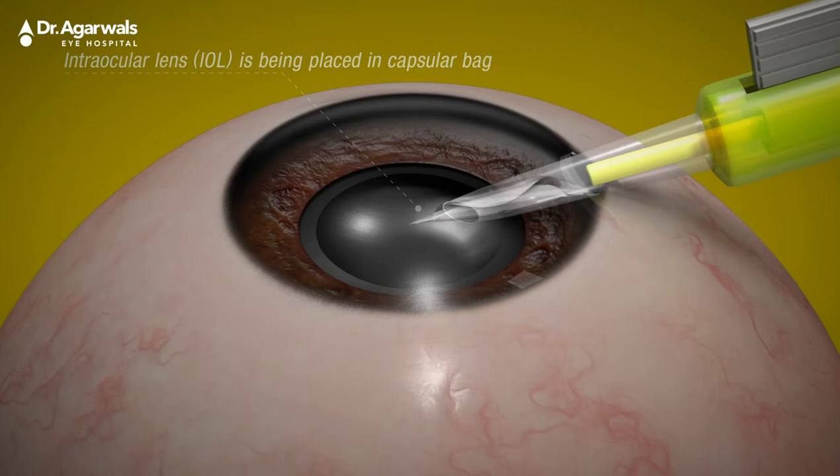The ideal location for insertion of an intraocular lens is the original anatomical position of the human crystalline lens within the capsular bag in the posterior chamber. The bag provides not only long-term stability and secure positioning, but also prevents damage to intraocular structures, mainly the posterior surface of the cornea or the endothelium.